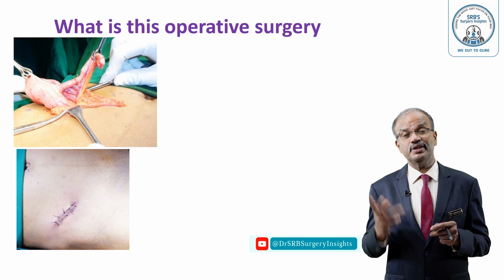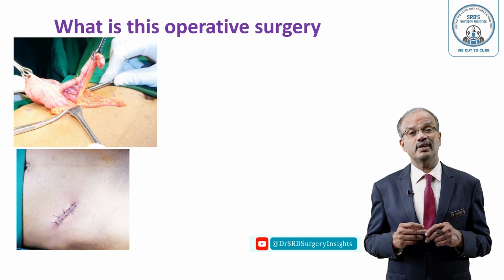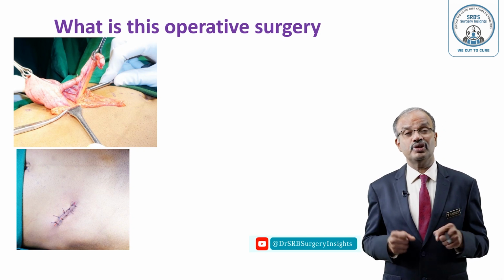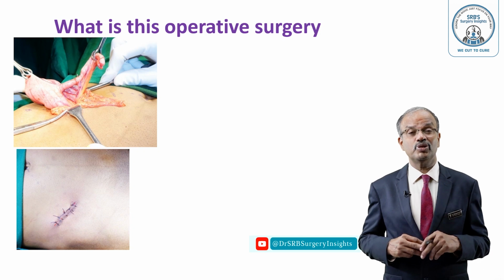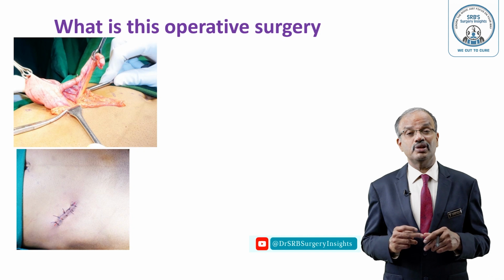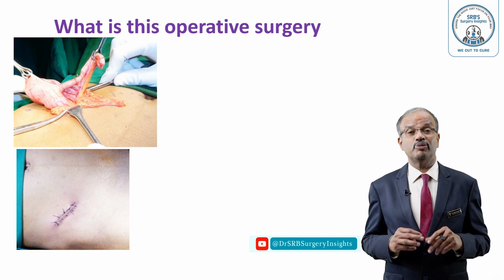Again apply the same artery forceps distally, then transfix the crushed area with the 2-0 polyglactin 910 vicryl suture, figure of 8 suture. Then after that, one more suture with silk or vicryl, a free ligature proximally. So 2 ligatures should be there proximally, and distal to that the appendix is cut with the number 15 blade, and the stump is cleaned with antiseptic solution.